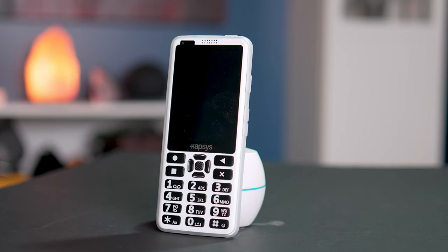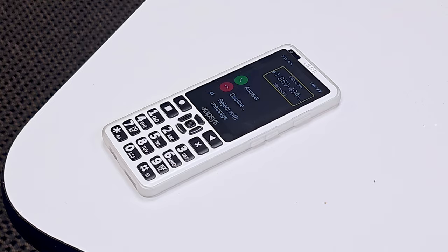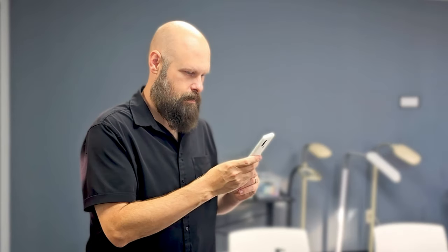Today we are taking a look at the new SmartVision 3. This is a very interesting accessible Android smartphone that utilizes both a touchscreen and a full physical keypad. We'll take a closer look at the SmartVision 3.